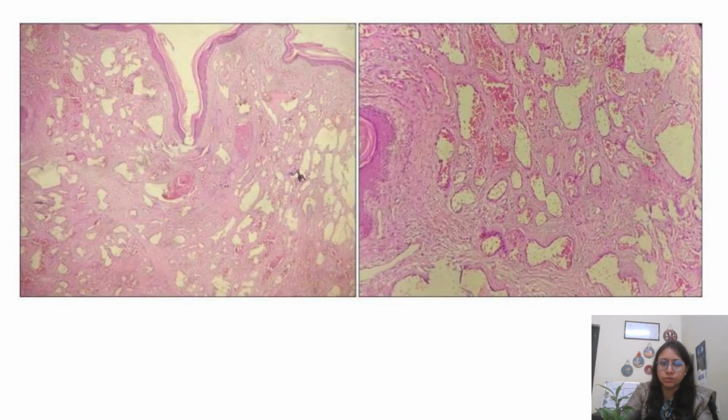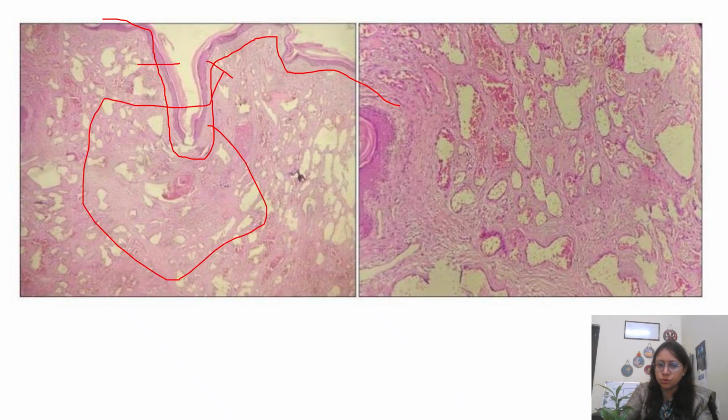So this is what I was talking about. This above is your squamous layer, a keratinized stratified squamous epithelium. All the layers of the epidermis you can appreciate. Now below the epidermis is your dermis, the whole thing. Below this epithelium, in the whole dermis, what you can see is variably sized dilated blood vessels, and these are fibrin filled. You can see the RBCs, small fibrin pink reddish dots within the lumen, and these are the vessels lined by your thin single layer of endothelial cells.